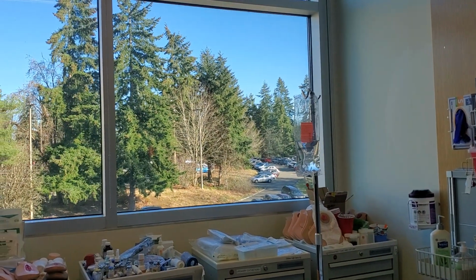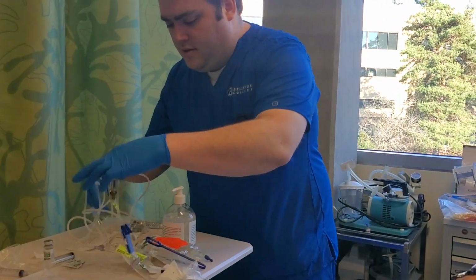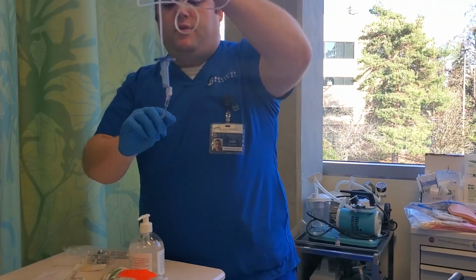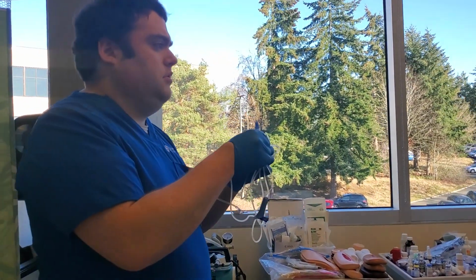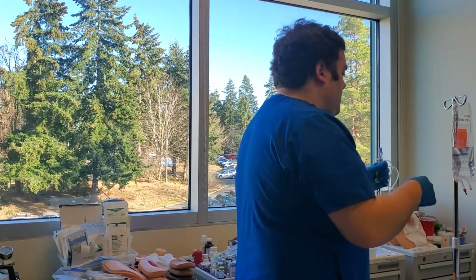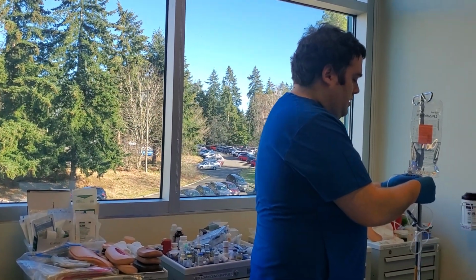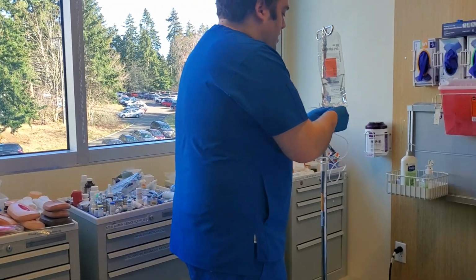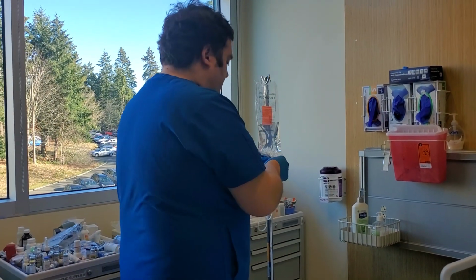Alright, so let's grab primary tubing. I'm sure this will have this. So we're using this, but this would be new. So then we'll go ahead, take, oh, wow, okay, so that is not what we would want to have happen.